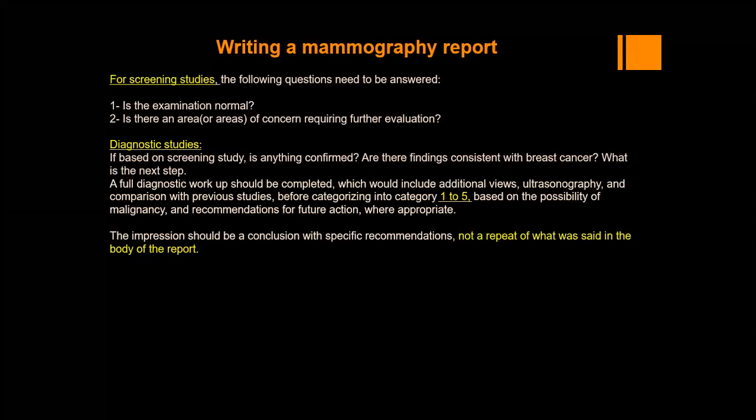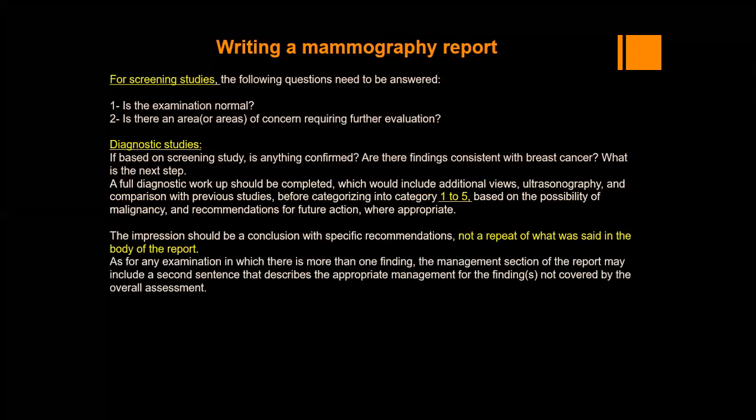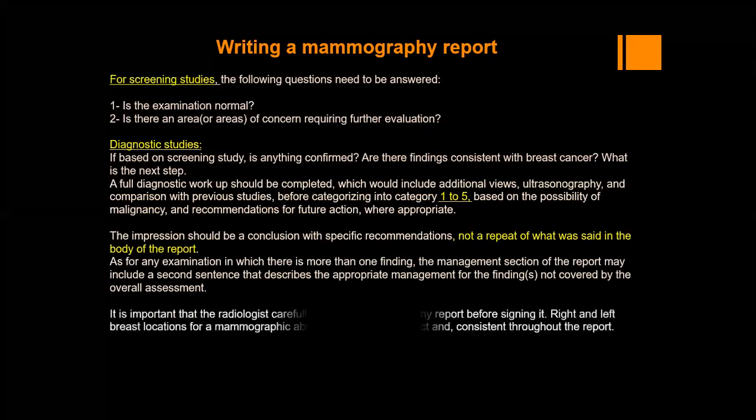We should not repeat again what we described there. We should just talk about the recommendations or the category and the management recommendation. As for any examination in which there is more than one finding, we described this already. We said we can add another sentence.